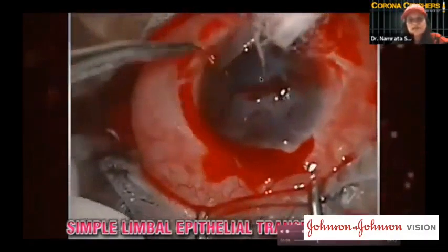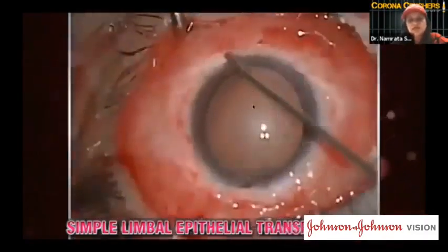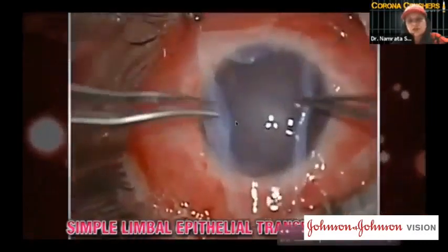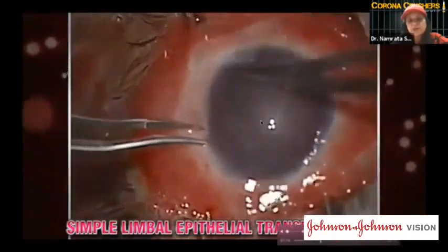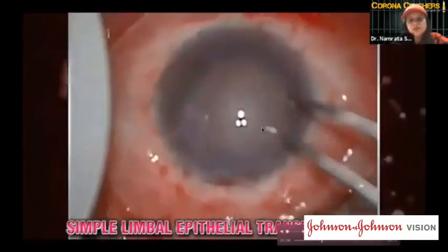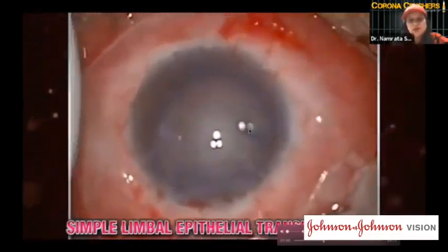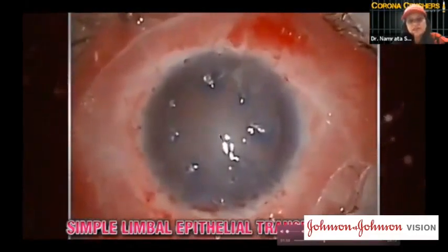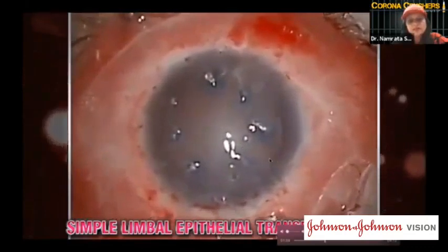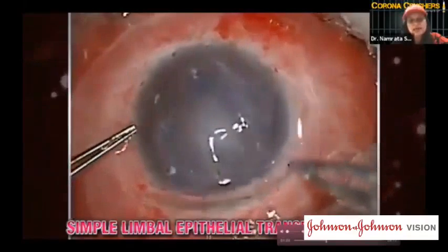So when you look at cases of limbal stem cell deficiency, and this is a chemical injury, you pinch the conjunctiva where it is loose and do a 360 degrees peritomy, and as you do it, it is just ready to strip off. And just notice how the underlying cornea and the underlying surface is so clear. So a glue is placed onto the corneal surface, followed by the amniotic membrane, and the limbal lenticule, which had been obtained from the fellow eye, is cut into small pieces and then is placed circumferentially all around except the central area, which is left clear, and this is again pasted with the help of the glue. This is followed by a bandage contact lens application.